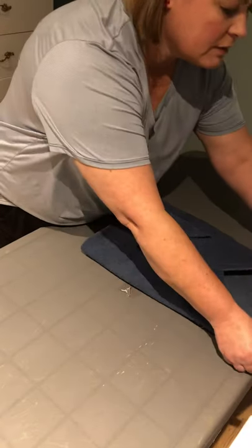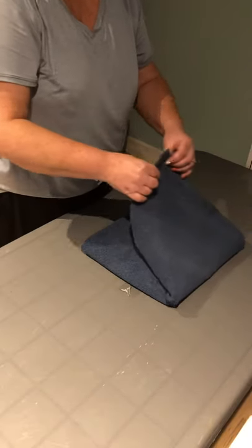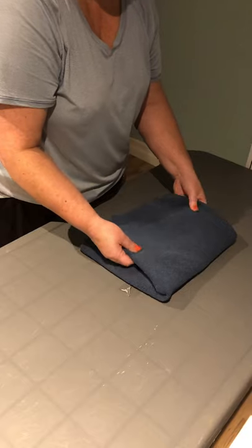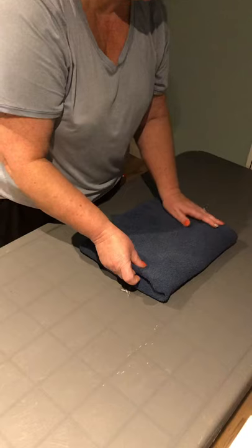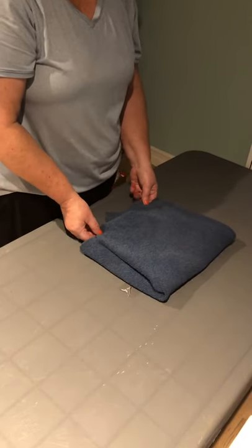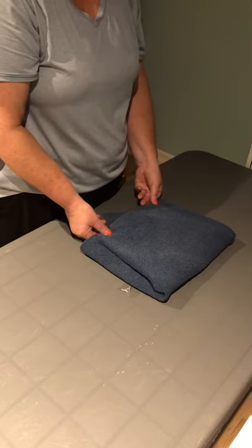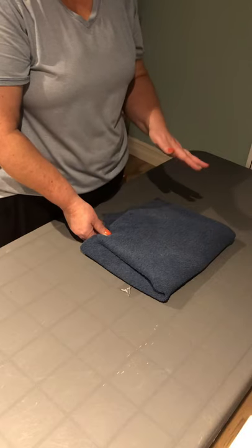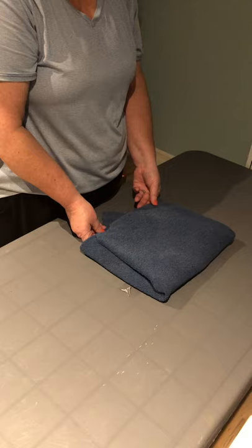I will then take the top corner down over the package, pulling it not too tight or too snug because we don't want the material to rip or snag, but we don't want it to be too loose either.